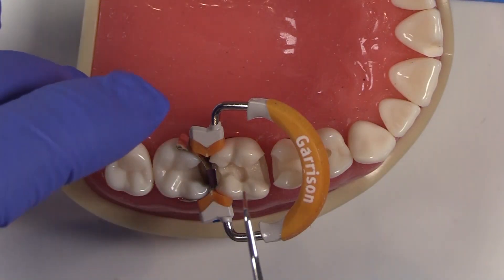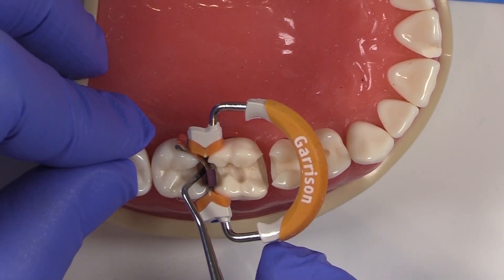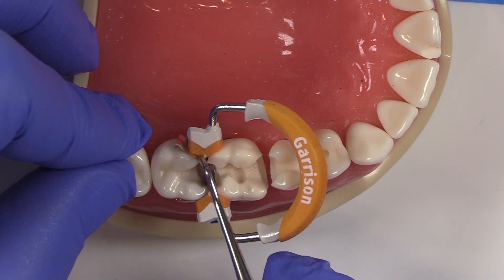I want to assess how I am and define my contact area. So I'll use a rounded instrument to kind of create this here. And then you notice how there's space right here where I could improve and minimize my finishing, right?